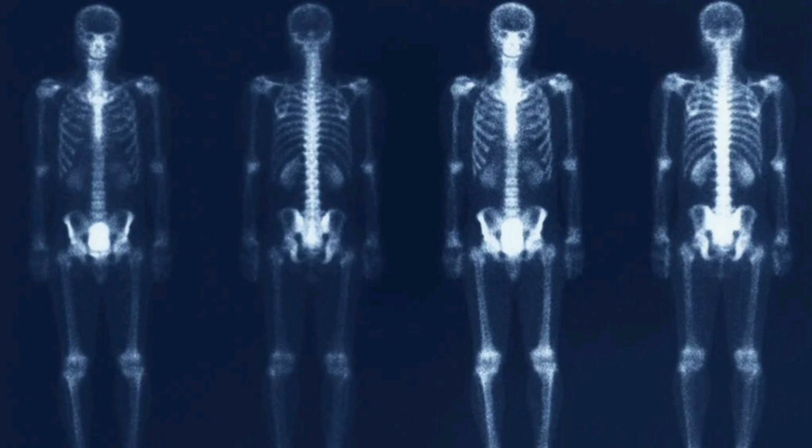Superscan. Superscan is when intense symmetrical activity is seen in bone with diminished renal and soft tissue activity. This occurs because of diffuse metastatic spread, renal osteodystrophy, metabolic bone disease, Paget's, and osteomalacia.